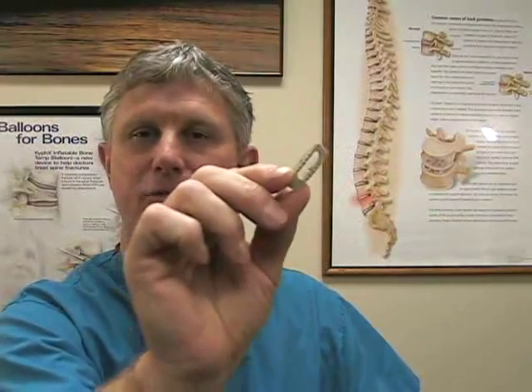We occasionally will do this, although we've changed a little bit in what we're doing, in that we're still doing a lumbar interbody fusion. However, the devices that we're using are a little bit different. Currently we're using, and again you'll see other examples of these, little plastic implants called PEEK, which is a high-density medical plastic. This is inserted in the disc space, and then it's packed with a material called Infuse, or other bone morphogenic proteins, and these proteins actually form bone better than your own bone would, so we usually augment the device by implanting this bone morphogenic protein into the device, which forms bone faster than your own bone.